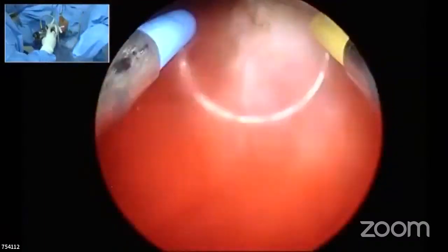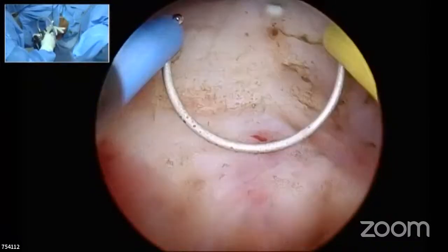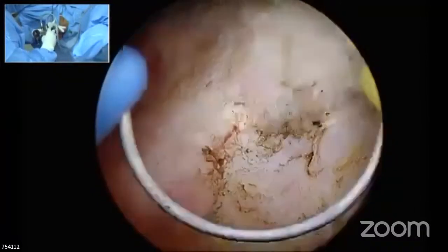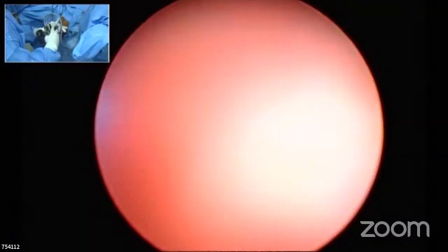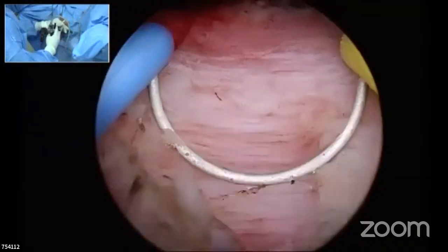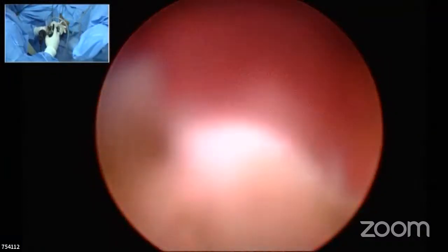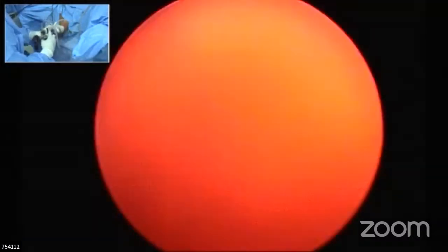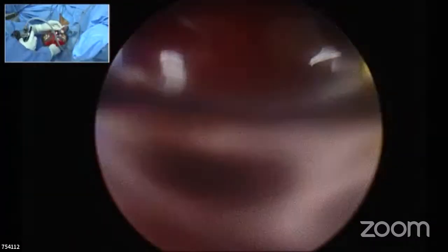See, wherever there are elevations, as a surgeon you want a good, nice cavity to look at, and that is what you try to achieve. I would never try to resect this bladder neck excessively, sir. The bladder mucosa, these fibers are to be left behind. Unnecessary excision of those fibers is not going to be of any use. There is some bleeder which is making my vision a little poor. Possibly I need to check where it is exactly.